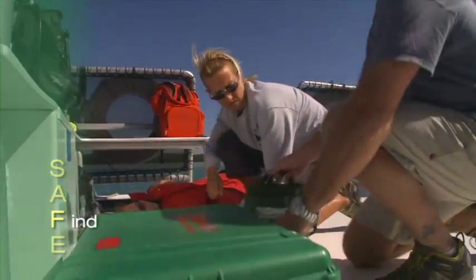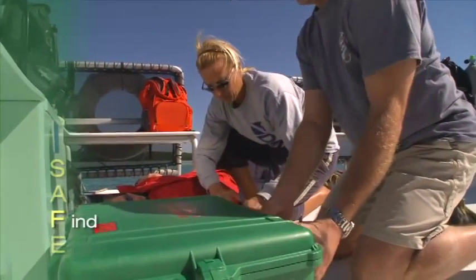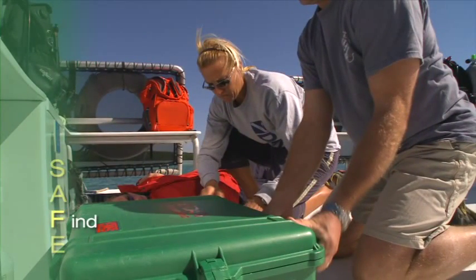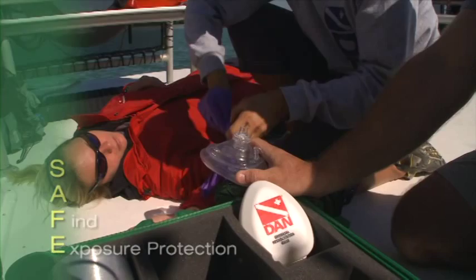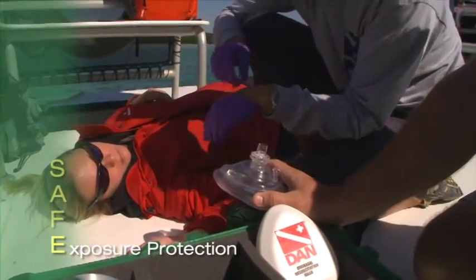Find your DAN oxygen unit, first aid kit, and AED unit. You'll need to locate your personal protective barriers such as gloves and oronasal resuscitation mask. Use exposure protection to avoid contact with blood and other bodily fluids.